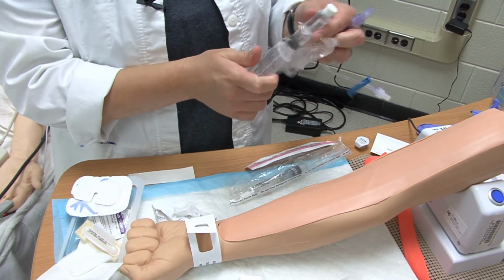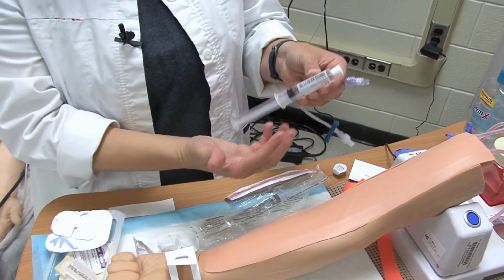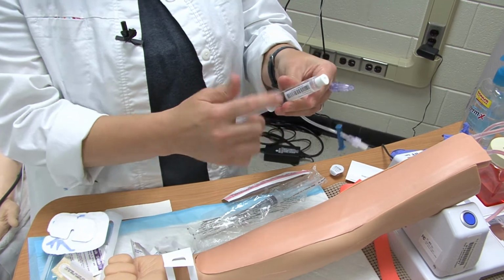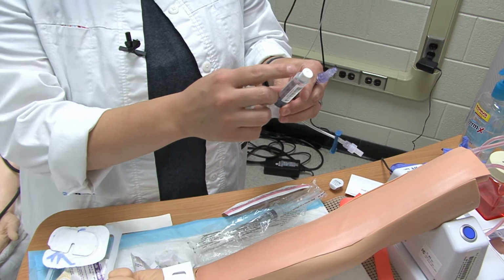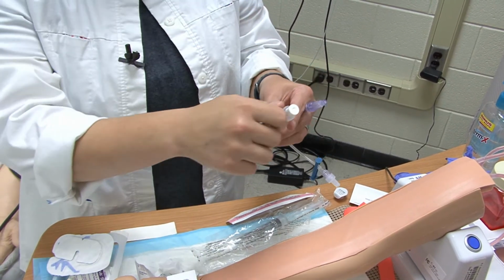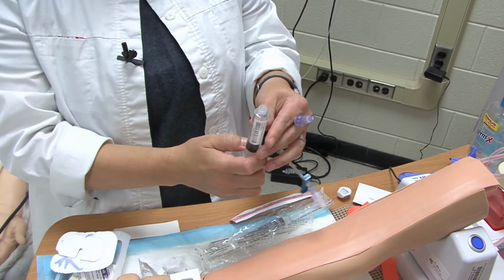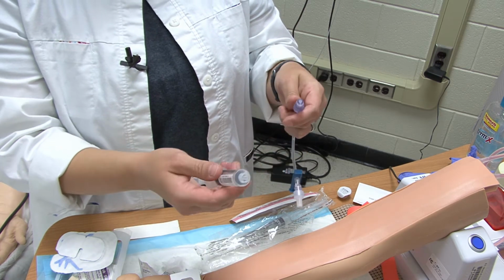So at this point, I'm going to take the actual saline flush out. Before you do anything with it, you either need to come to the bottom and push up on it or pull back on it. And what that does, there's a seal inside of here, so that if you didn't do that, when you took the cap off and you went to flush it, you'd have to break the seal and you'd likely squirt the patient or the ceiling. I'm going to take the cap off, and I'm now going to squirt the air out. And it comes out a lot easier like that. If you hadn't broke the seal, then you'd have issues.